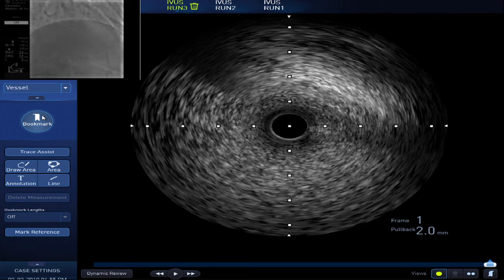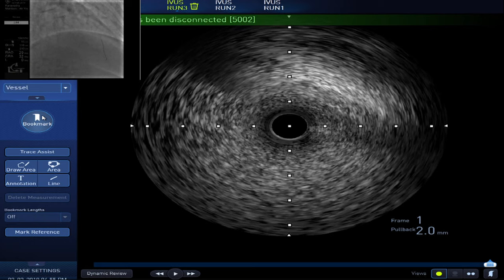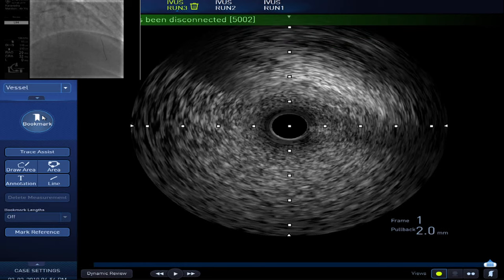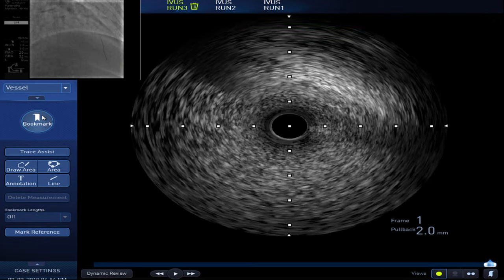Hey, this is going in. So guiding set bar karo. It's out. The guide is out. There's no pressure. But it is going in. I know. But EKG looks okay. Okay, good. Okay, start. We have it. We got pressure now. Okay. It was just here. Why was there no pressure, though?